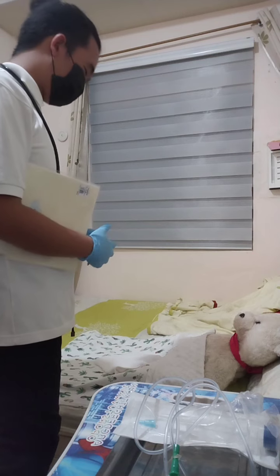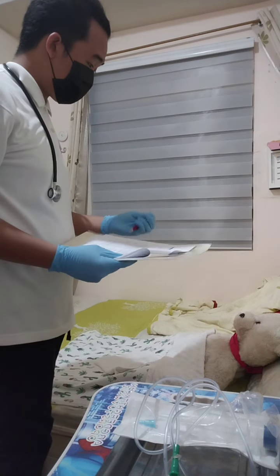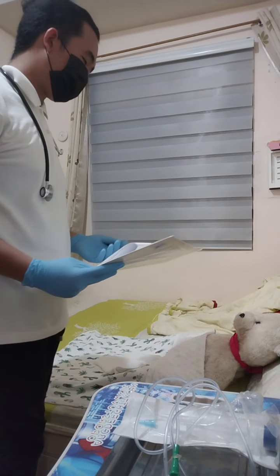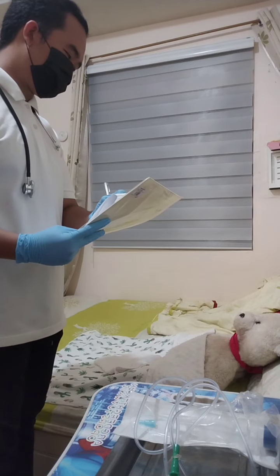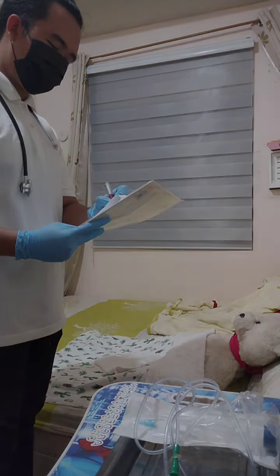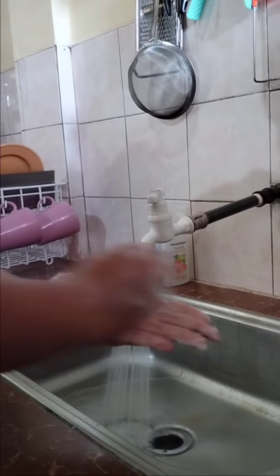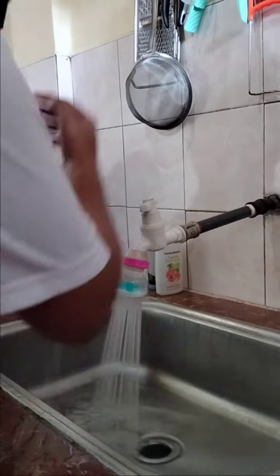First procedure, explain the procedure to the patient. Discussion and explanation help allay anxiety, encourage patient cooperation, and prepare the patient for what to expect. Second procedure, perform hand hygiene. Hand hygiene prevents the spread of microorganisms.